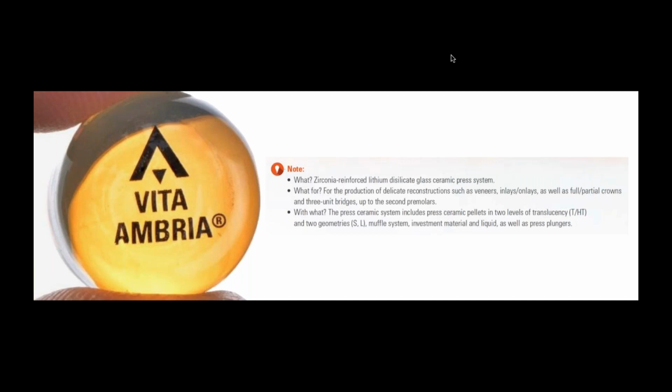If I have very thin veneers on very nice color of abutment teeth, then there I would say that the HT would be a nice option. Also, if I'm doing, let's say, an inlay or onlay, and the depth of the preparation has a nice dentin color, the HT will blend really nicely in this type of partial coverage restoration.